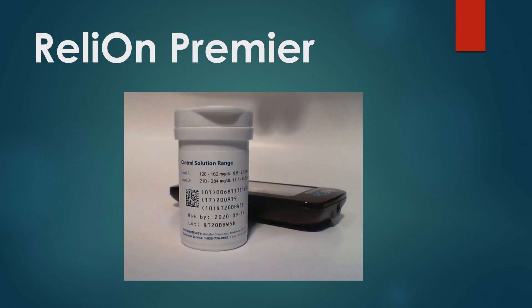Let's run through a couple of examples. This one is the Rely On Premier by Walmart. You can see it has level one and level two. When you use that control solution, level one should come in between that range and level two in that range. It's important you refer to the range on the test strip bottle — it's going to be different for each bottle of test strips, which is a point of confusion for some folks. You always want to look at the bottle of test strips you are using the control solution on. Walmart does not sell the control solution in stores; you call the number on your meter or test strips and they will send it to you.